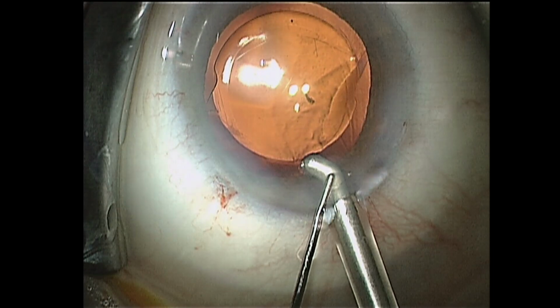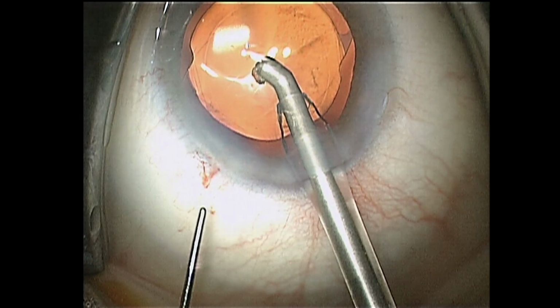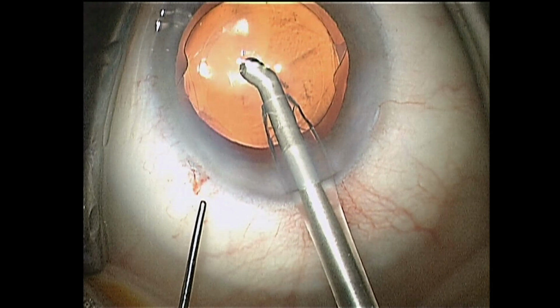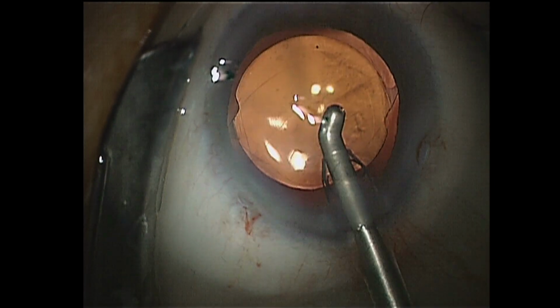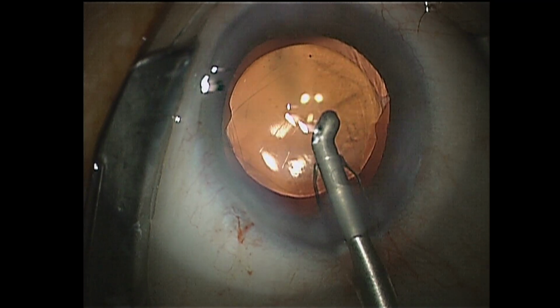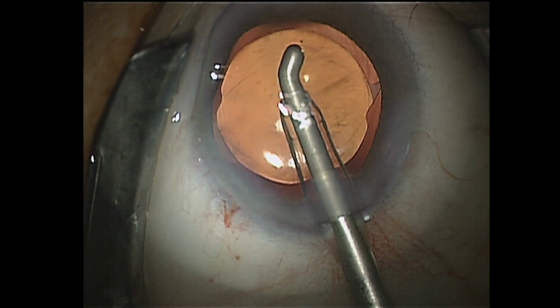After draining some of the OVD by depressing the tunnel bottom, and after hydrating the paracentesis openings, a coaxial I&A probe is inserted and the residual Healon aspirated with the aspiration port pointing upwards and to the sides. Finally, the I&A probe is quickly retracted to allow the self-sealing corneal lip to shut down, thus excluding anterior chamber shallowing.